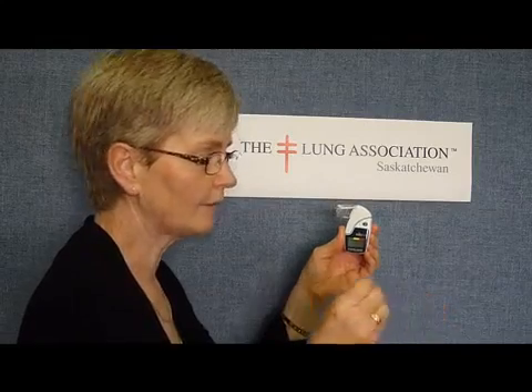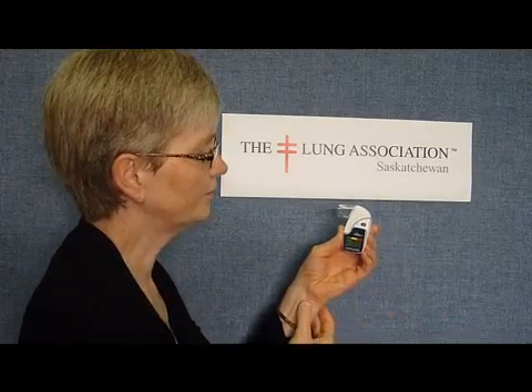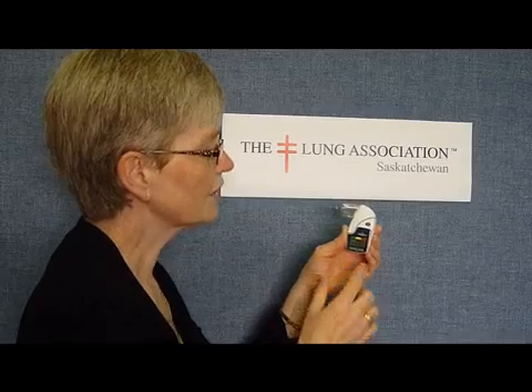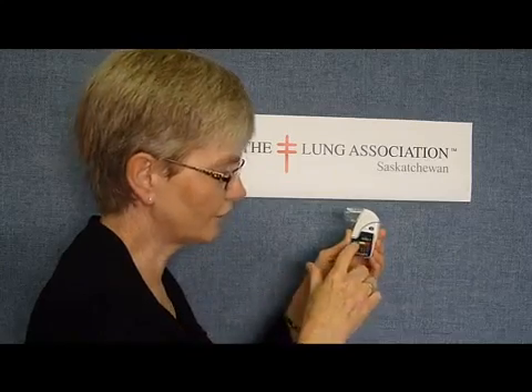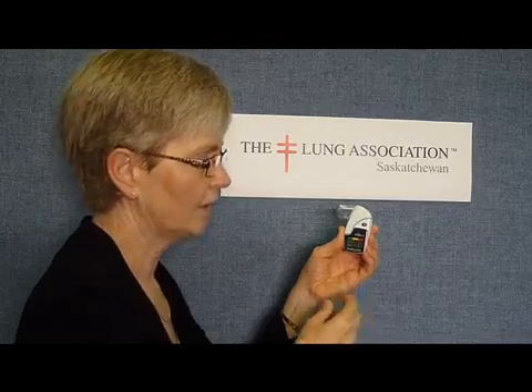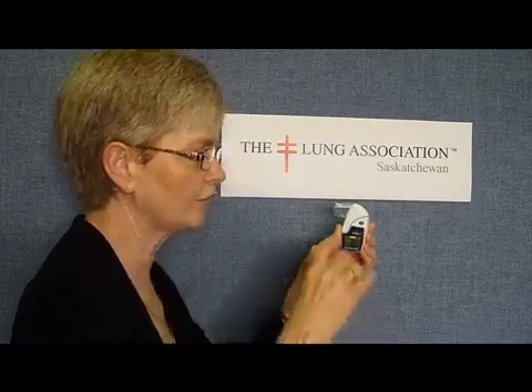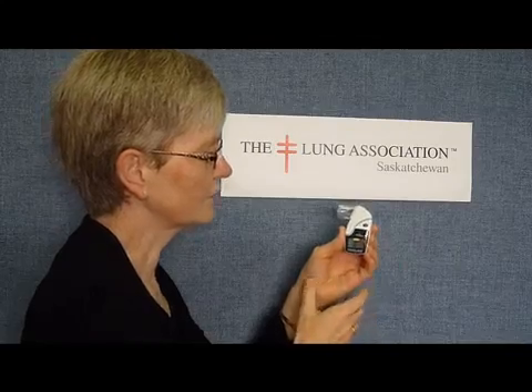So I'm going to turn it on and show you how to do it. The on-off button is here — I'm turning it on. You'll see that it has numbers on there from the test before, but I want to be sure that it's at zero when I do my next maneuver. So I'm going to hit this button twice and then do my next maneuver. I'm going to take a big breath in and blow it out through this machine. So I'm going to zero it — I've got zeros.